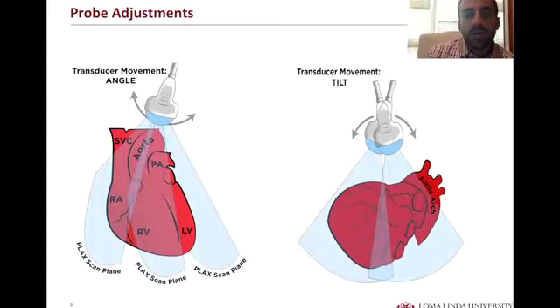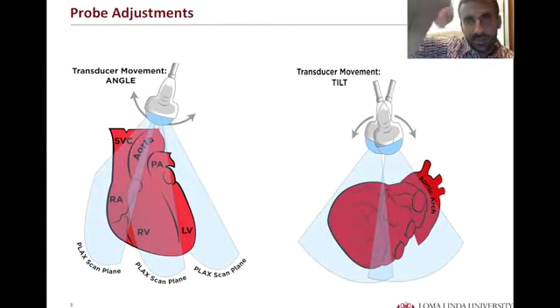Just to review, tilt and angle, very important to be familiar with the motions. Tilt, if my fingers here are the ultrasound plane, moving along the ultrasound plane is tilt, moving opposite to the ultrasound plane is angle.